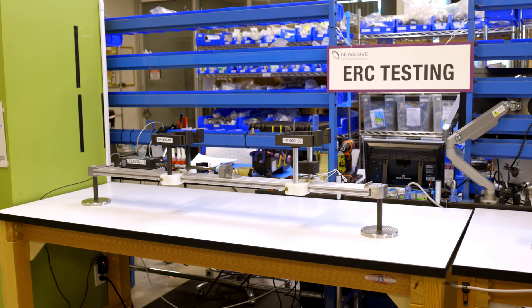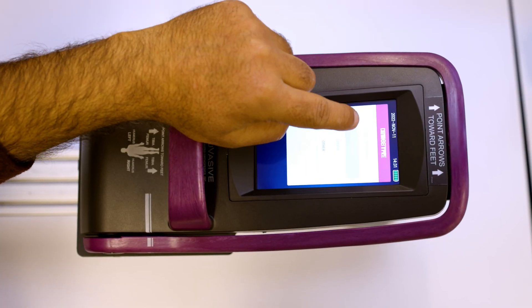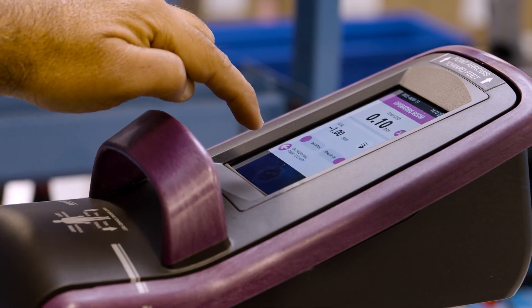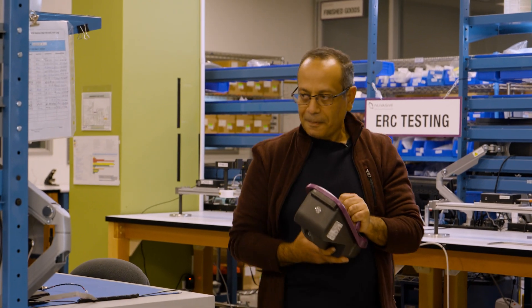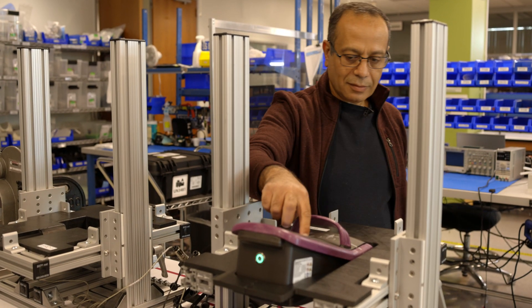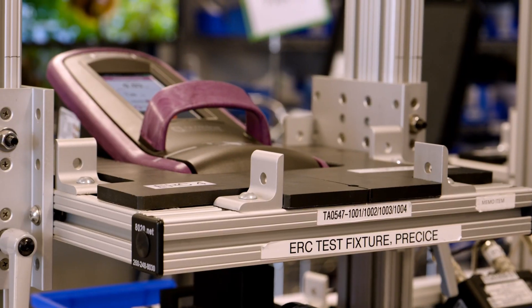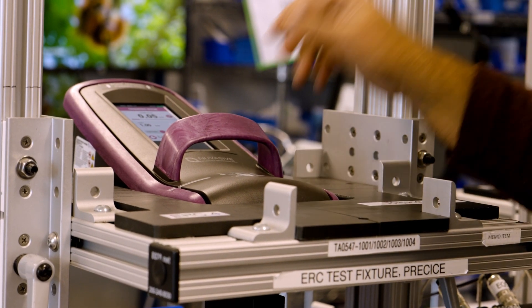After that, we go through the testing. The first test is about sensing — we're going to make sure the unit is sensing when it needs to, and when it's connected between the nails, we make sure the sensor is on. The second test is about the magnet — we're testing the torque to make sure the magnet is strong enough for the patient, because we have different types of patients. After the technician completes the two tests, the unit will go to quality control.